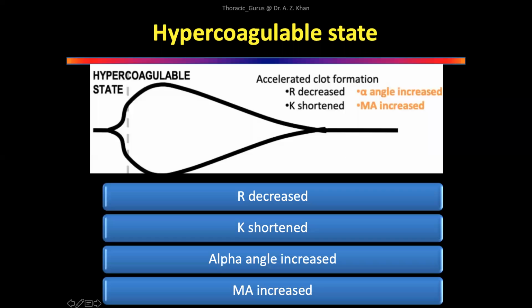Yeah, this is not something that you do routinely, but it's worth knowing. There are two more situations that you have to study. So we studied delayed clot formation. We looked at the presence of platelet blockers. We looked at the hypercoagulable state. We looked at fibrinolysis.